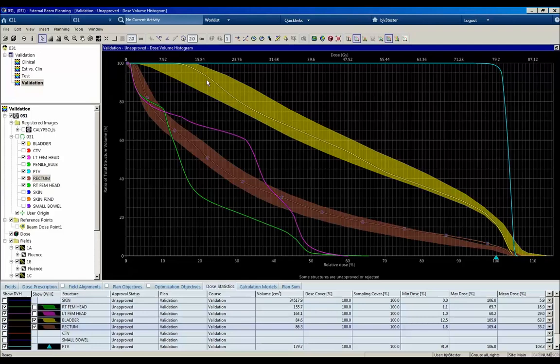There are several situations to consider during this validation step. If the optimized DVHs easily meet the lower bound of the DVH estimation and the PTV is well covered, or the optimized DVHs never meet the upper bound of the DVH estimation and the PTV is not well covered for all validation patients, this might throw a red flag that your model is not estimating achievable DVHs.